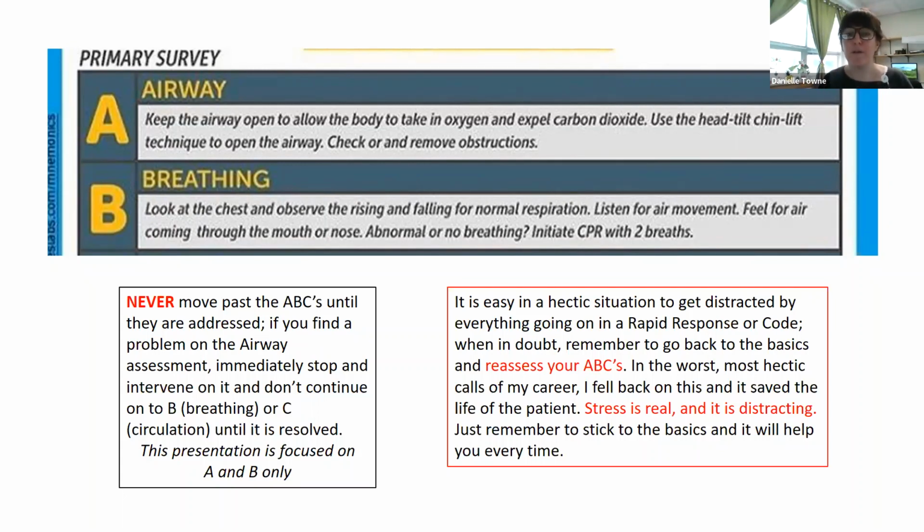Now, remember that in really hectic situations, and this can happen when you have a patient that you think you're potentially going to intubate, things can get really crazy really quickly. So just always fall back on your ABCs. Check that airway, check the breathing, check the circulation. Realize that stress is very real and it's very distracting. So just stick with these basics that we're going to talk about, and I'll help you get through all of the situations that we're going to encounter.